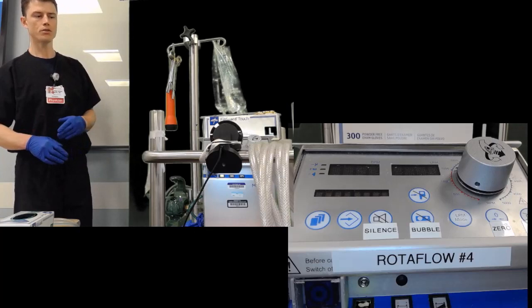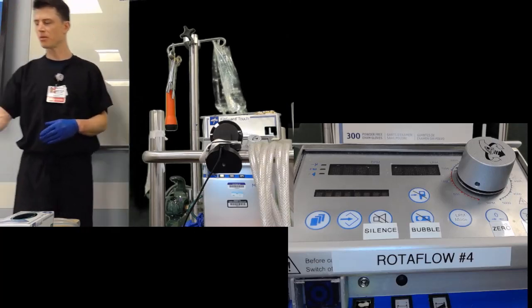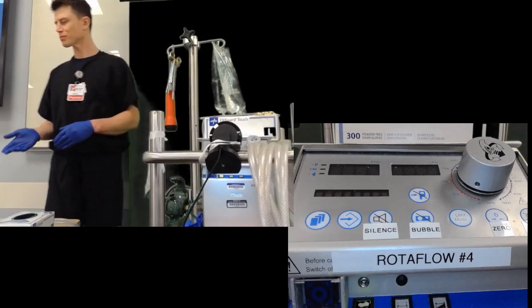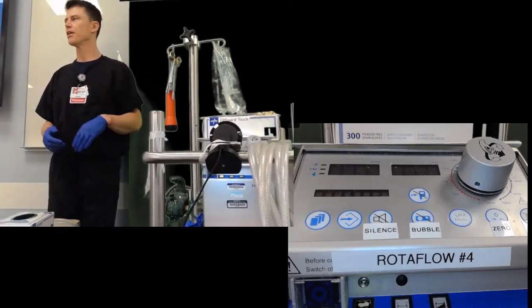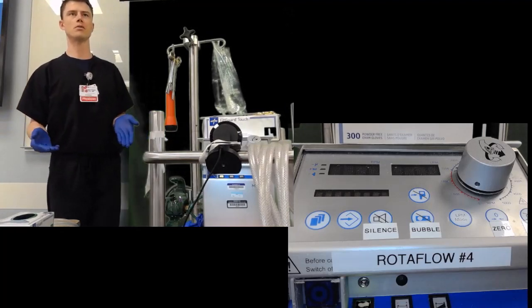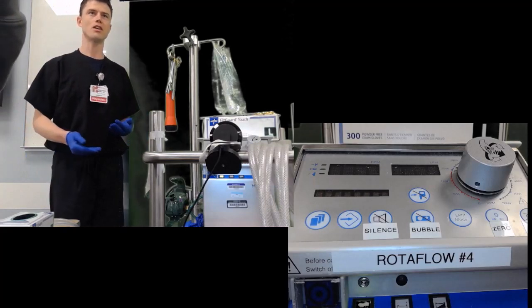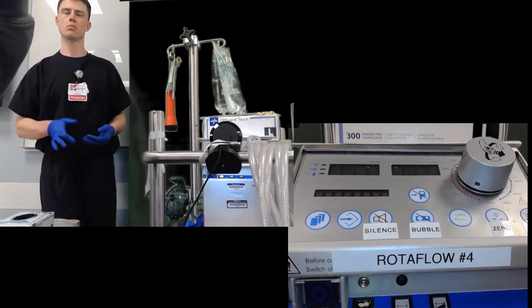So let's start off with a patient, Mr. Bagel, who's on ECMO. The circuit is just turned off, so we're trying to turn it on and get everything going. So this is a real thing, right? If it turns off, it's not that simple just to push the button and it turns on. So going through that is helpful since we've been using this machine here at Cooper.